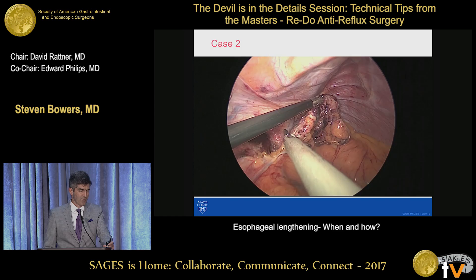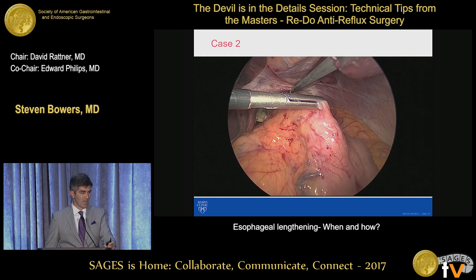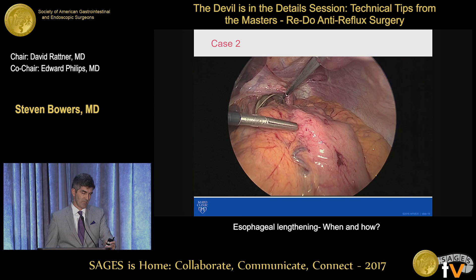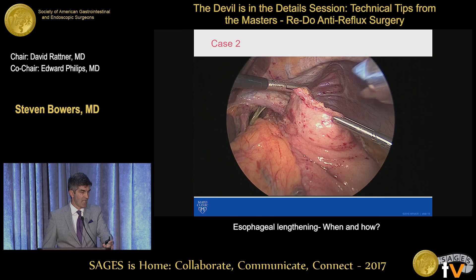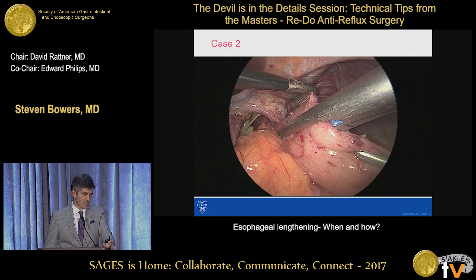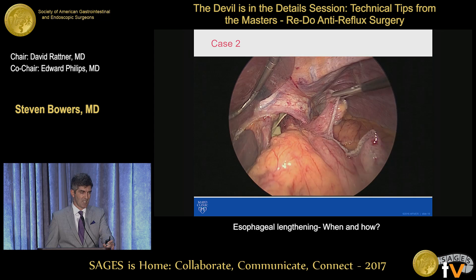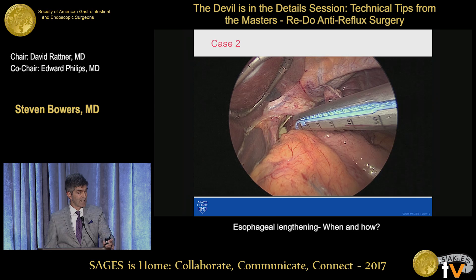So once you have this anterior sac and anterior esophageal fat pad off, you have to truncate it — don't follow it all the way back to remove the posterior vagus or anything like that. Then you can see that we have about a centimeter of intra-abdominal esophagus despite a very high mediastinal dissection. So I have the patient pass a 50 French bougie, and we'll do the wedge fundectomy type Collis gastroplasty. I use the right-hand surgeon's port to place a GIA-60 — I always use a blue load for this — and you just try to touch the end of your stapler against that 50 bougie. Then fire, and you pick a point. I don't tend to mark it; I just try to eyeball it. But you want to be about 2 to 3 centimeters down from your GE junction.